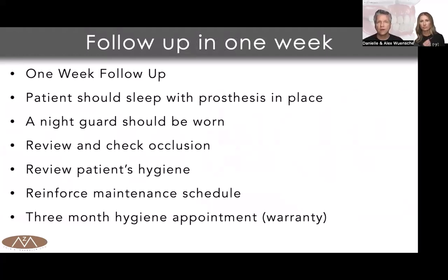So after 1 week is a follow-up, basically. Patient should sleep with the prosthesis in place, not just for 1 week. The patient actually should sleep with that prosthesis all the time. Night guard, usually I always recommend for all restorations wearing a night guard.